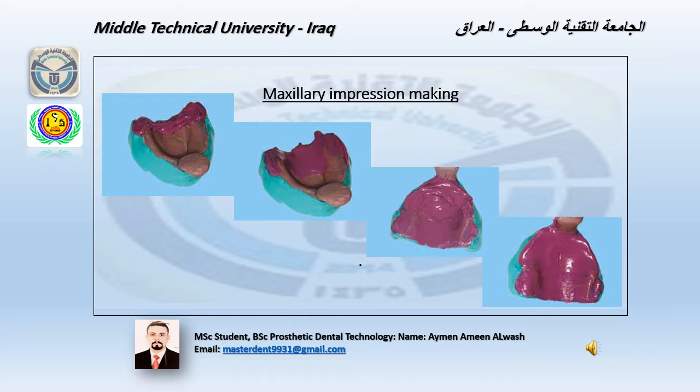Maxillary impression making. The same technique that we use in the lower impression complete denture record, we will use the same in the complete upper impression material recorded.